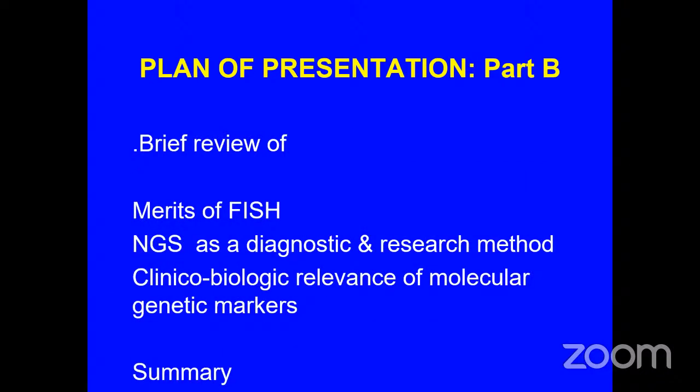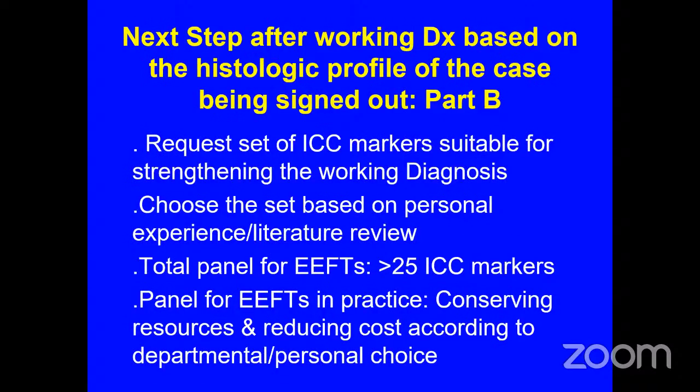So after that, I will briefly review the merits of the technique FISH and then say a few words about next generation sequencing as a diagnostic and research method, and a few words about clinico-biologic relevance of molecular genetic markers. And I will briefly summarize what we have discussed in these two presentations.